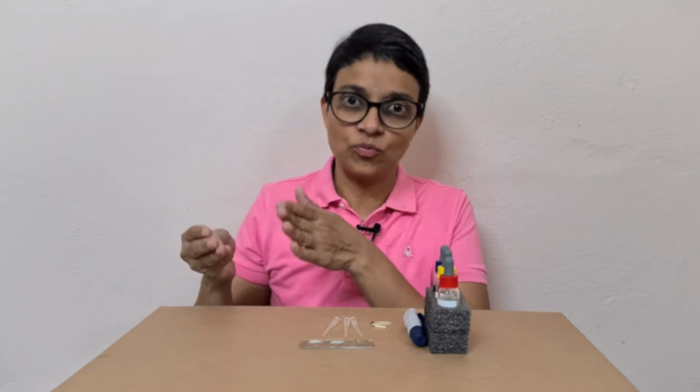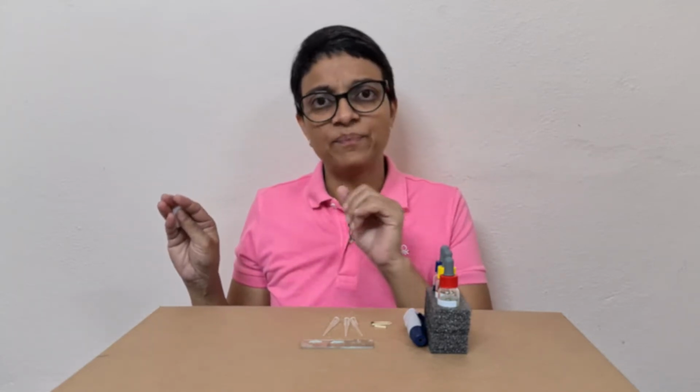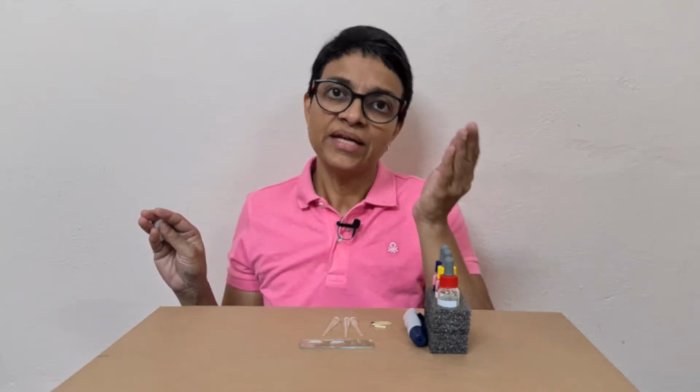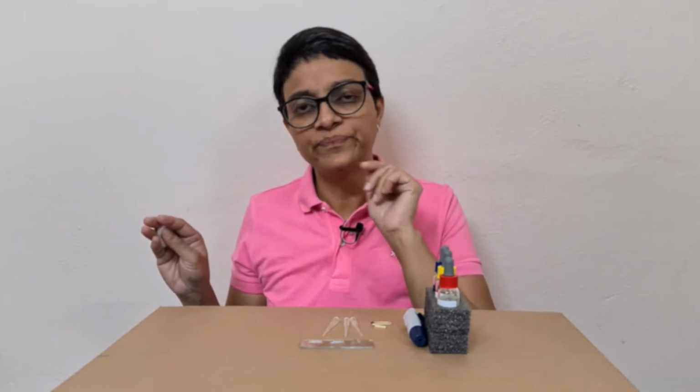Only B antigen, B blood group. No antigen, O blood group. Suppose the mother is of O blood group. That means she doesn't have any antigen on her RBC. And the father is of A blood group and he is heterozygous for it. That is, he has A and O. Then if they mix together, the child will be A.